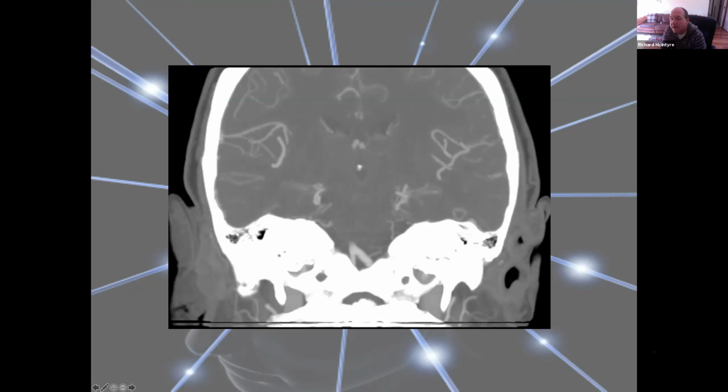Yeah, good. Another good question, Vicky. Contrast does have an effect when using T2, but only a very small effect. And we have to minimize, and we have to maximize it when we do T2. So essentially, I'm going to say, certainly at this point of your learning, no. It only has an effect when using T1, okay, or a very, very minimal effect on T2.